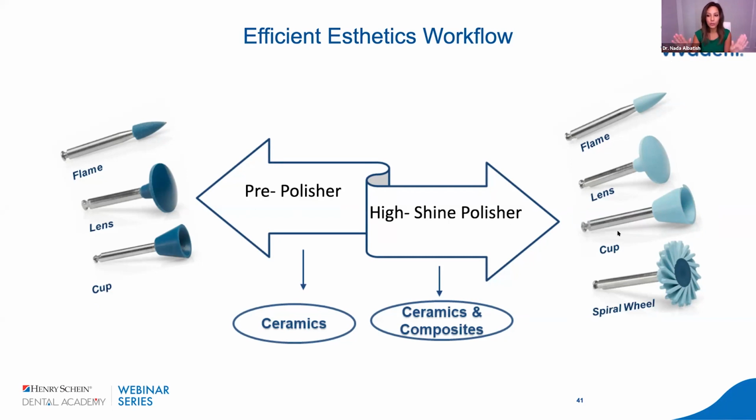30-second polish. If you're doing a composite, use your high shine light blue polishers. If you're doing a ceramic, start with your dark blue pre-polisher and then move to your light blue high shine polisher. And that's it, you're polished and done.